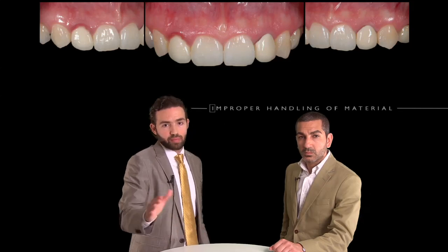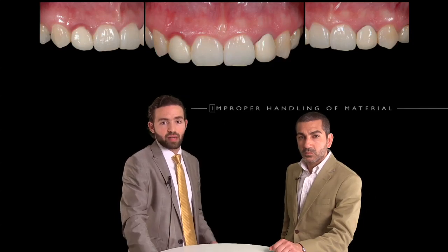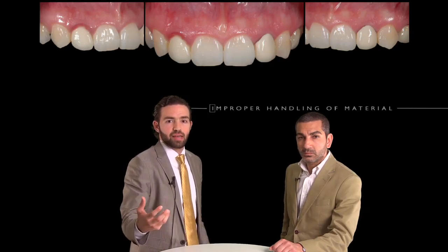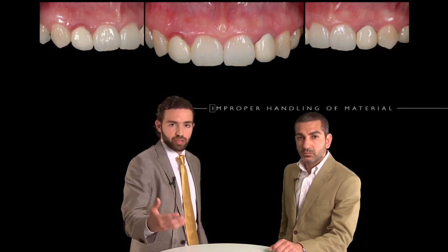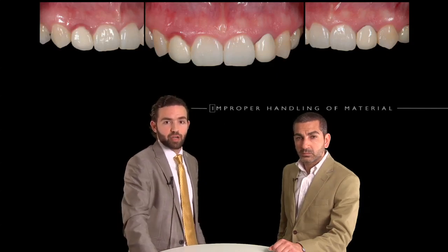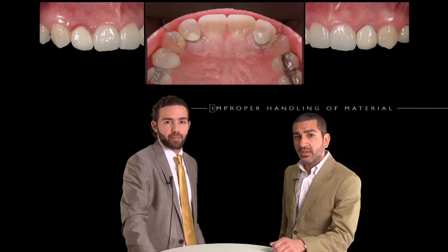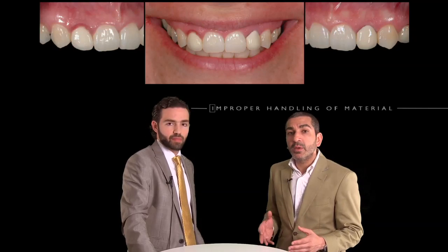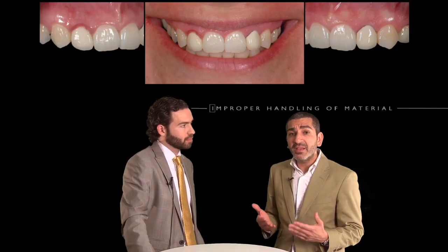While on the other side of the screen, the left lateral incisor is opaque, and in terms of handling and providing space from the operator to the technician, it is really not enough. And you see how the outcome is very opaque. You see from the palatal view how the two restorations are very opaque. And you can see the technician has tried to cheat and overcome the problem with a lack of space by bringing that lateral incisor forward and overlapping it. But even that was not enough.